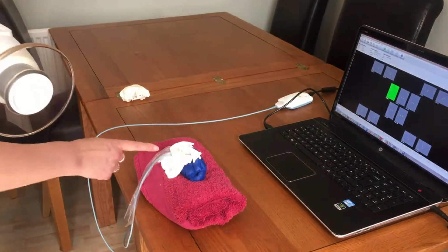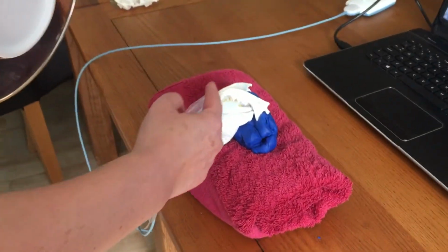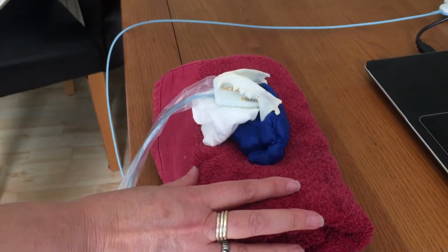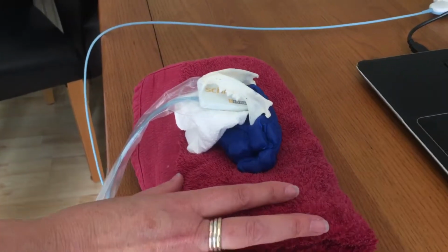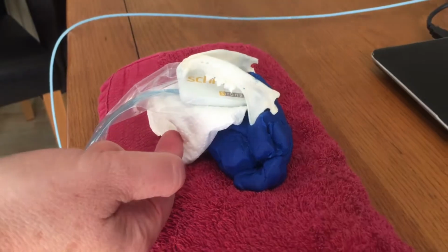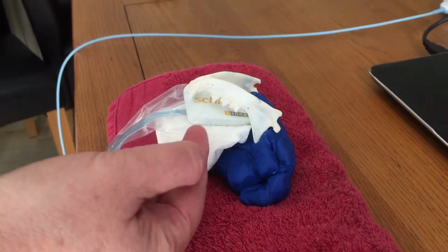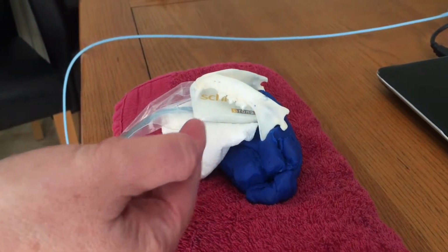So we've got our Schick sensor in portrait rather than landscape. We've obviously got the cat in dorsal recumbency on a rolled up towel. It would be about this angle, and we've got a piece of gauze underneath the sensor, keeping that against the teeth, saving it flopping away. Doesn't matter if the tongue is between the sensor and the teeth, that's fine.